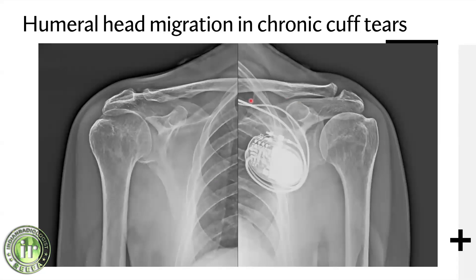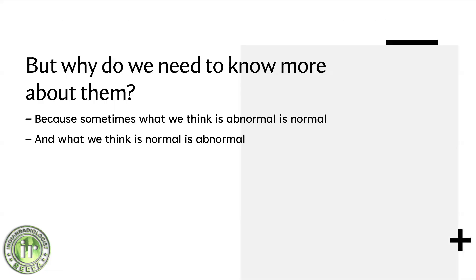Another thing we look for very often is to see if the humeral head is high-riding - in other words, if it has migrated superiorly or is closer to the acromion compared to the opposite side, or sometimes just touching the acromion. This gives us an idea that somebody has had rotator cuff insufficiency, and more often than not it's chronic rotator cuff insufficiency when the humeral head rises up.